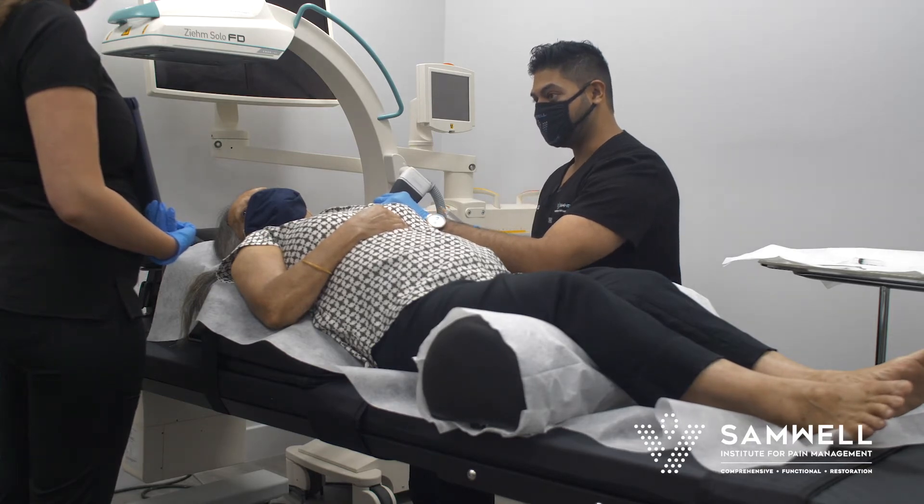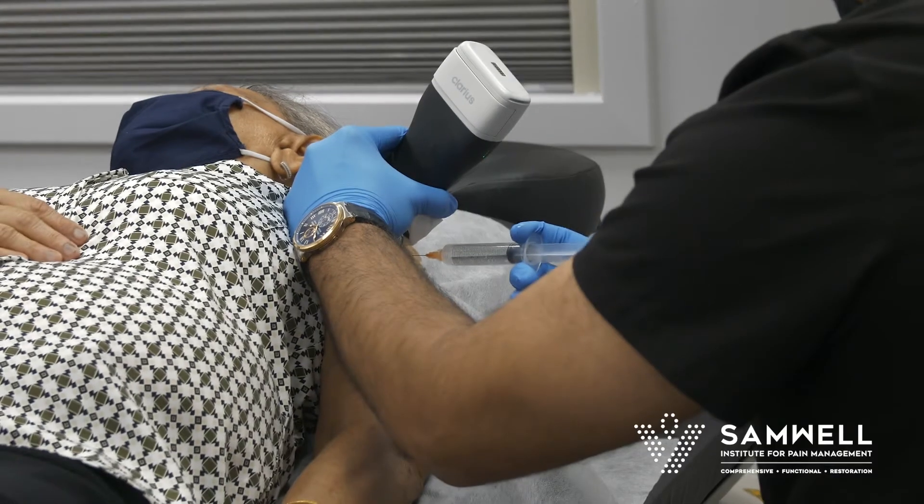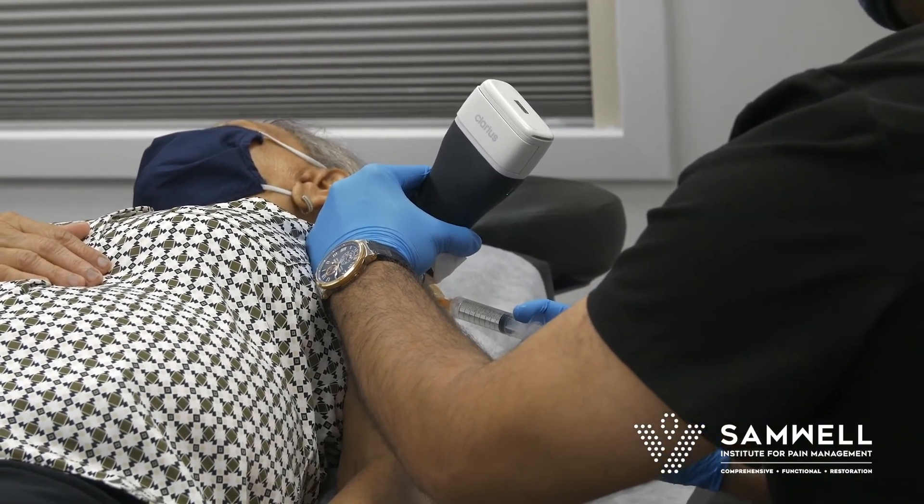So where you're going to feel here in just a second is some local anesthetic. Small pinch — one, two, three, and a little pinch. That's all local numbing, all anesthesia.